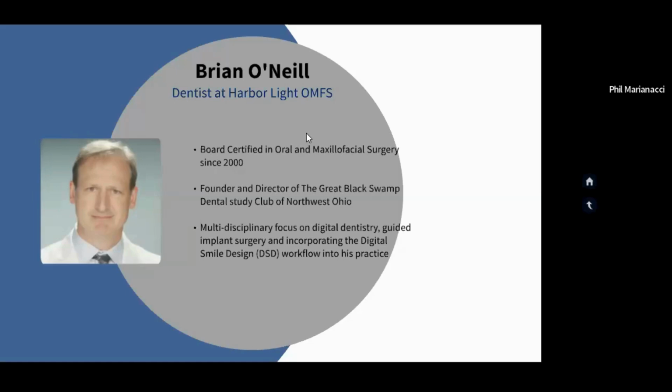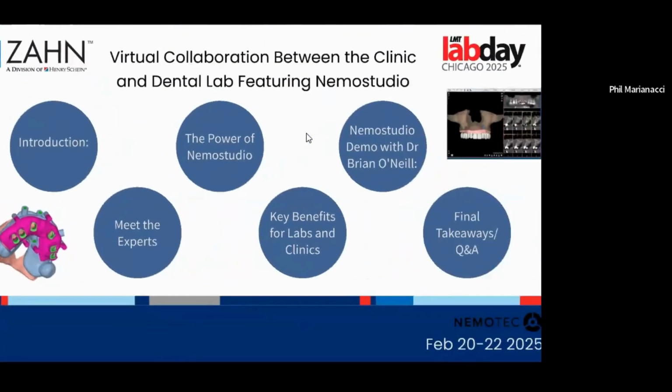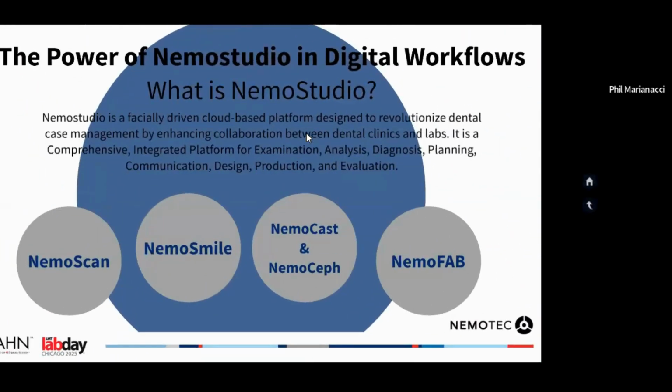So Dr. Brian O'Neill, again, turned me on to the Nemo Studios, and he does a good amount of guided implant surgery, and he does incorporate digital smile design, DSD workflows into the practice as well. Dr. Brian O'Neill is going to begin showing you, but I'm just going to give you a brief overview of what that digital workflow looks like for the Nemo Studios. It is a cloud-based platform, which I love, and it shows the case management between the lab and the clinic. And it does the diagnosis and analysis, planning, communication, design, production, and evaluation.